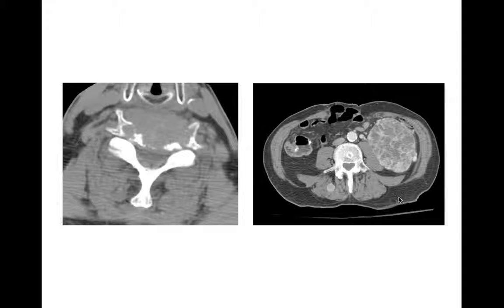And we can see here, here's the CT, so they had a giant renal mass. In this case, this was a renal cell carcinoma. And here's the axial CT showing you the lesion right here as well. And if you remember, renal cell carcinoma and thyroid carcinoma are the typical ones that give you expansile lytic metastasis. Not exhaustive, other things can do it, but I'd like you to think of those two as prototypical of lytic expansile metastasis. So things in the spine, Mets, multiple myeloma in an older adult, just think of those just because they're so common.